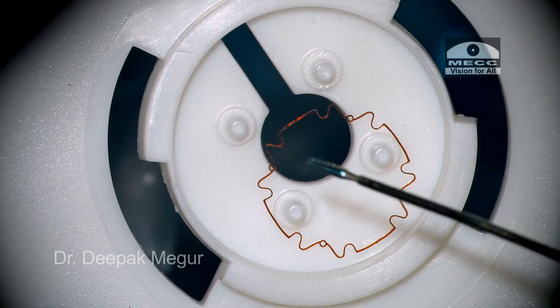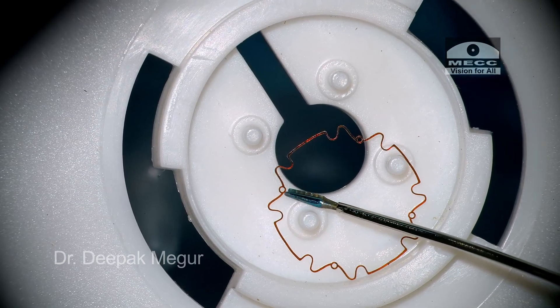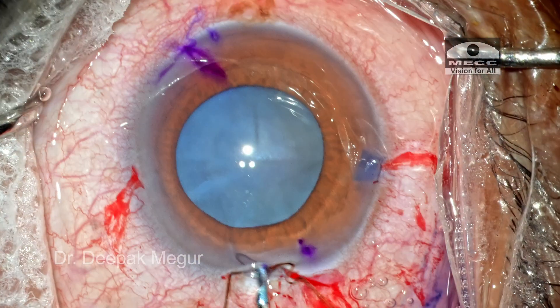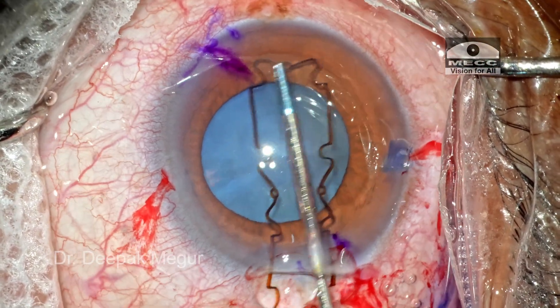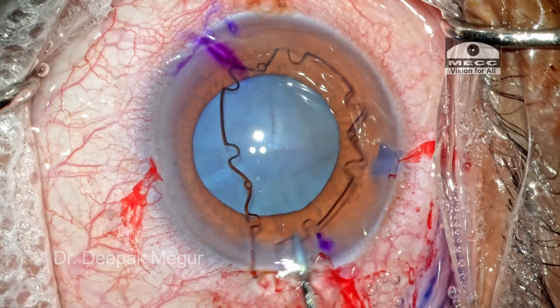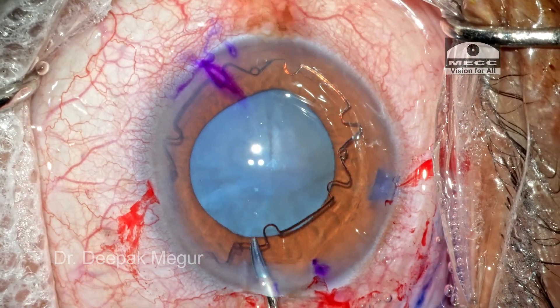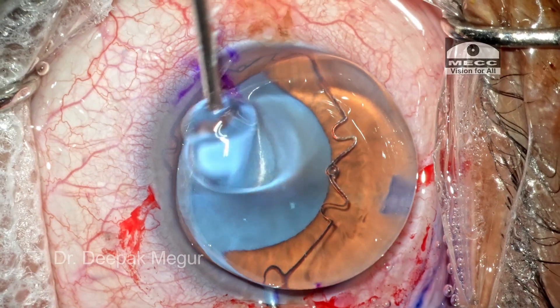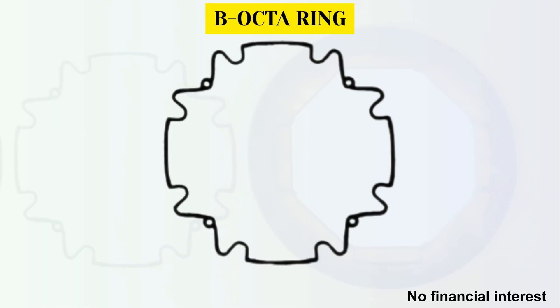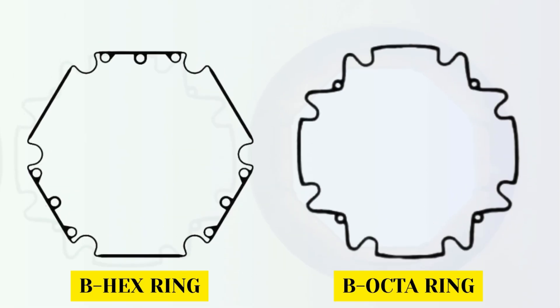The technique of inserting the B-Octa remains the same. It comes in a neat tray. We hold one of the notches and it is introduced into the eye using the B-hex forceps. The trailing part of the ring is gently maneuvered into the anterior chamber. As it sits on the iris surface, let's examine the design. The feel, profile, and consistency are just the same as the B-hex, as the material is the same. It is only slightly bigger in diameter.